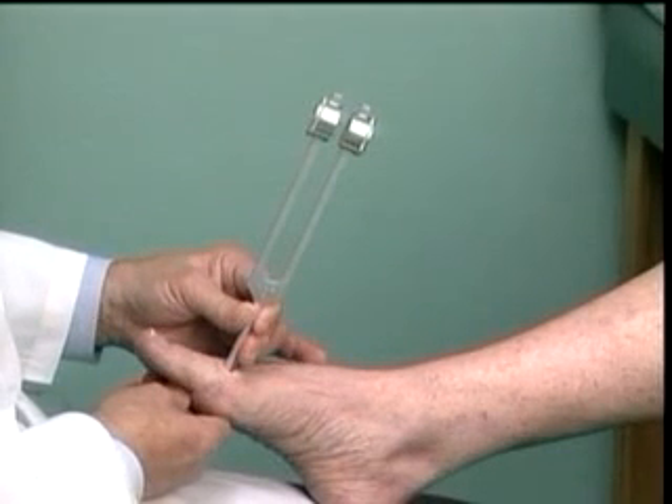A 128 cycles per second tuning fork is best for this exam.